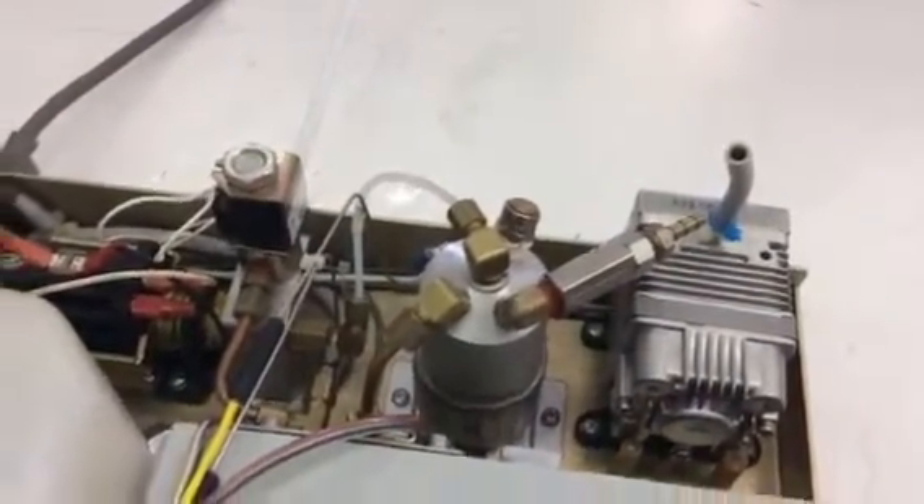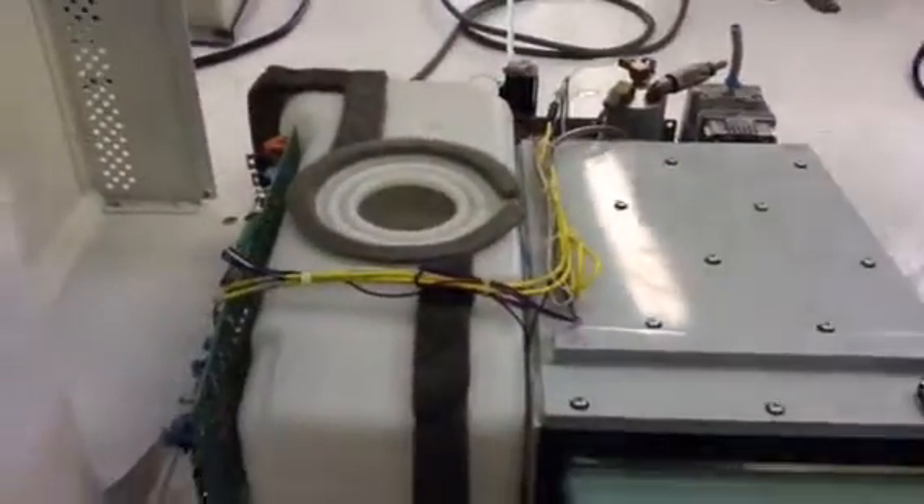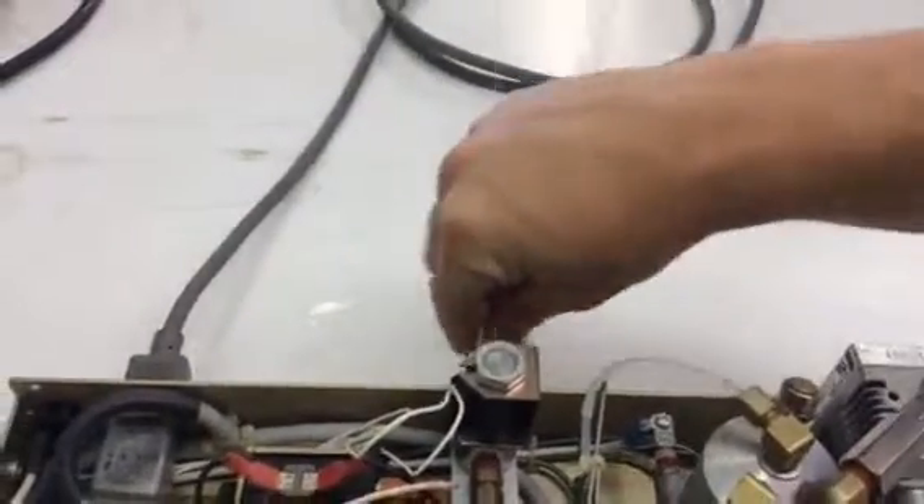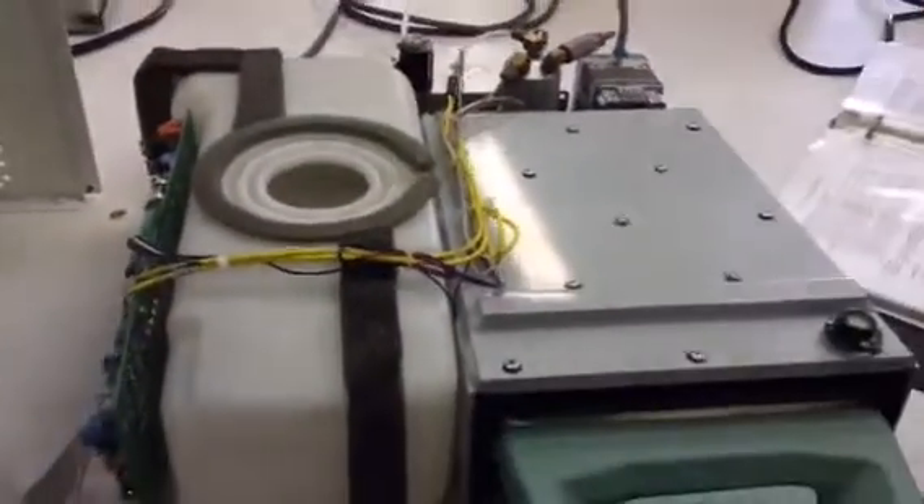If the cassette can't be removed, then we would go to this exhaust tubing. Make sure it's not kinked or pinched down here right by the fitting. That could be an issue, or if you pack too many instruments in your cassette, that could also be an issue.